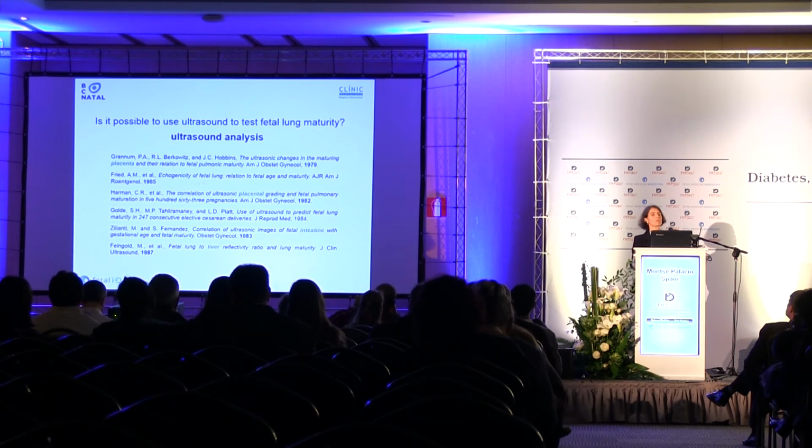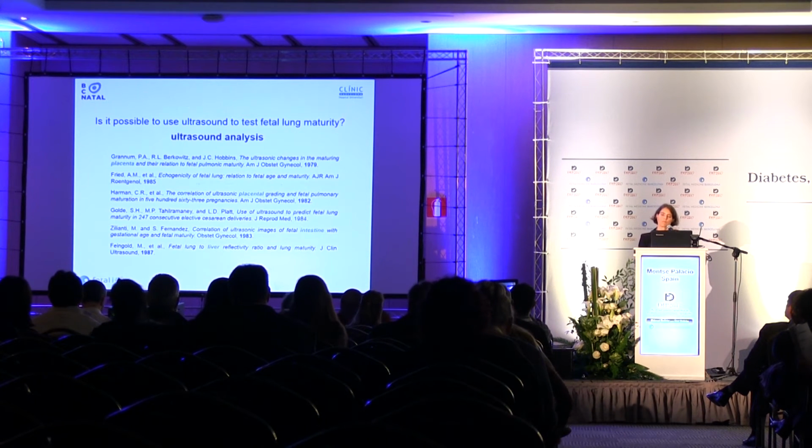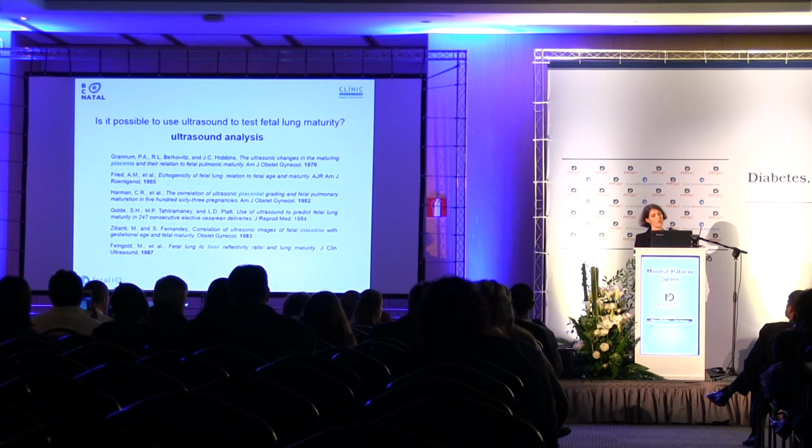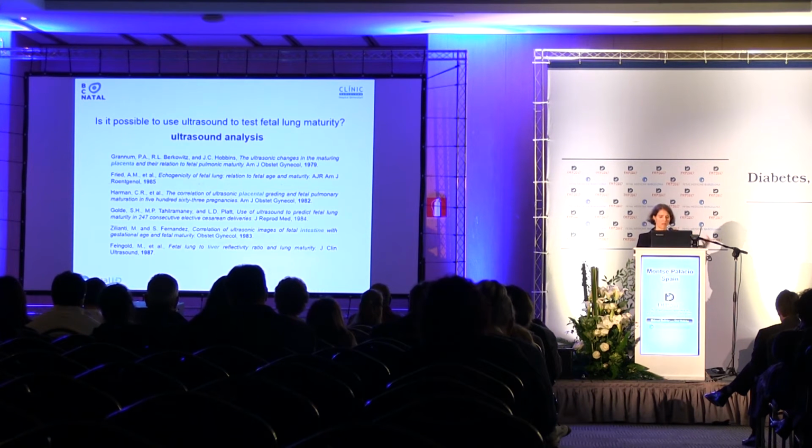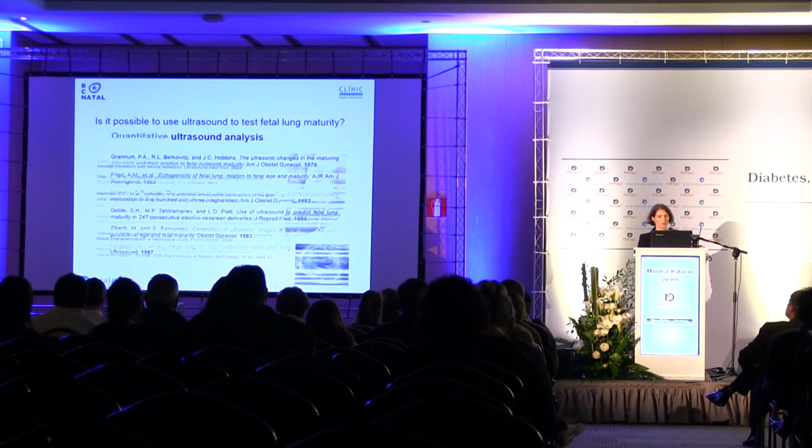So it's possible to test fetal lung maturity by ultrasound. This is a very old question. I mean, this is nothing new. You can see in the slide that from the 1980s, they were trying to get information from the lung by the scan to get information about lung maturity. But at that time, the technique was the problem. And we were comparing with other tissues, placental or the intestine or the liver of the fetus. We were getting some information, but actually this never went to clinical practice.